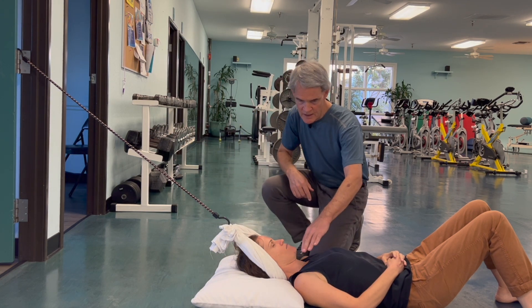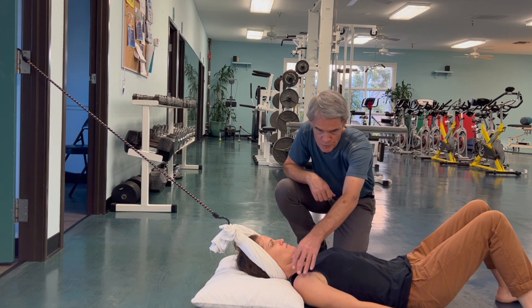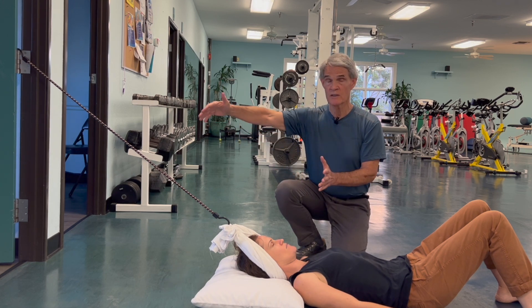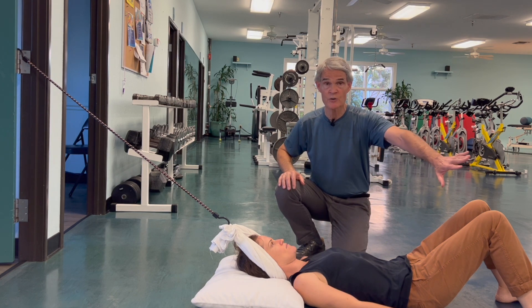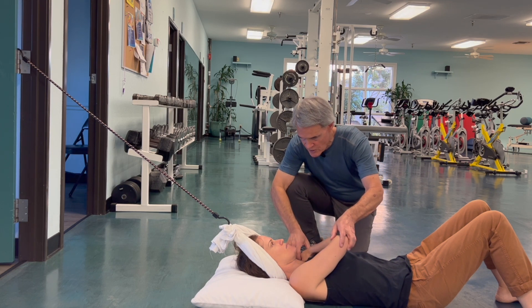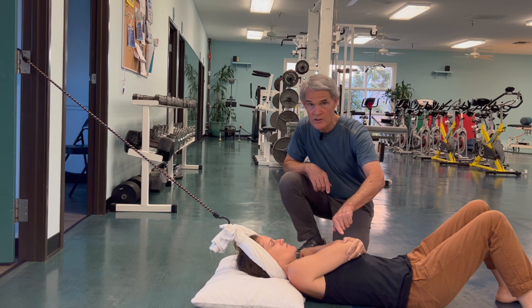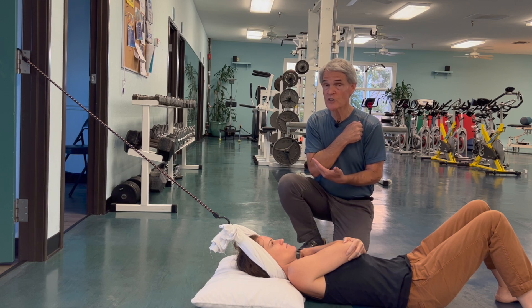If she's having a lot of nerve root symptoms — pain down into her arm — often when she is in this position the pain will increase, because the nerve does not like to be stretched. When you decompress the head, the nervous system is pulled cephalad towards the head. If the arm is down, it holds the nerves in a caudal direction. So if the nerve is angry, she will slacken it by making a gentle fist, elevating her shoulder girdle on that side, and using her other hand to support her arm — that is often the position of relief.